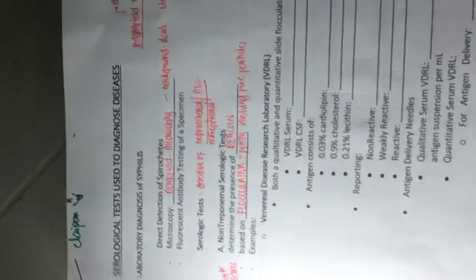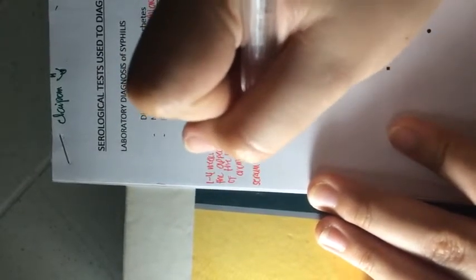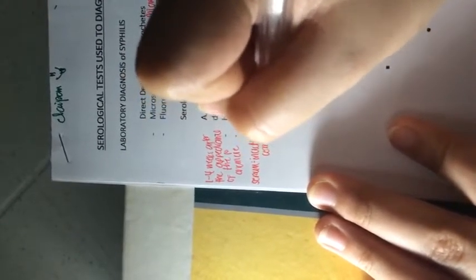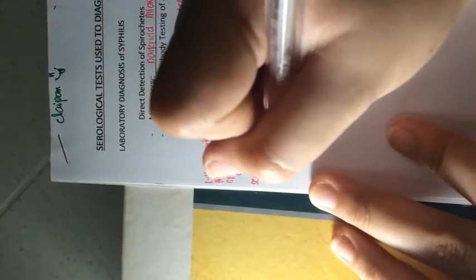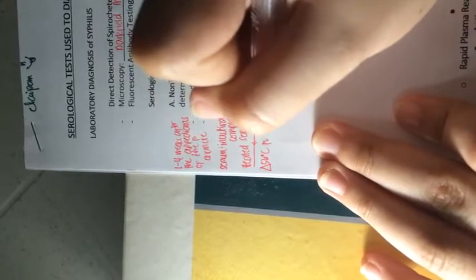to detect them in vitro. Please take note that the serum that should be used for the detection of non-treponemal antibodies should have inactivated complement components. Based on this, we can say that we should use a heated serum. If you can remember, heating is one of the methods in inactivating complement. Just for review purposes, inactivation of complement happens when we heat our serum at 56 degrees Celsius for 30 minutes.